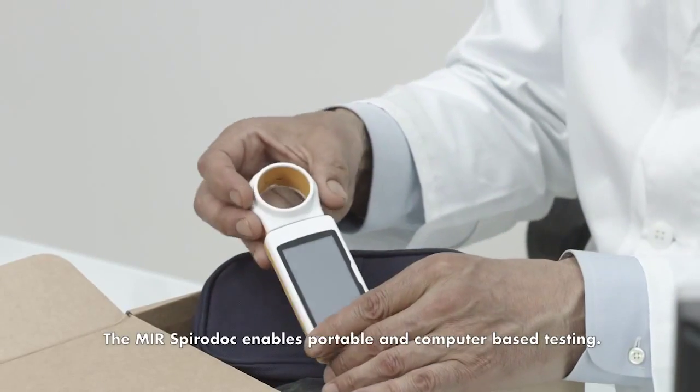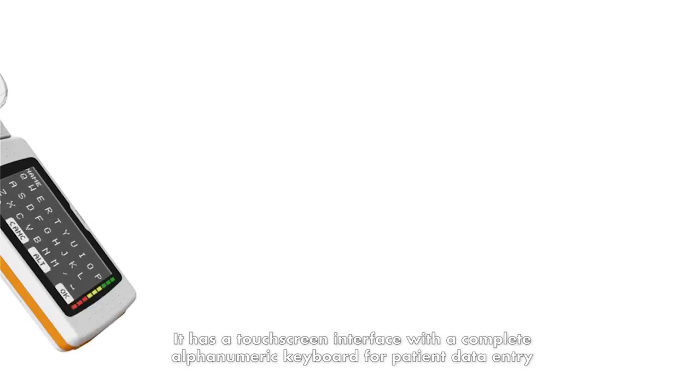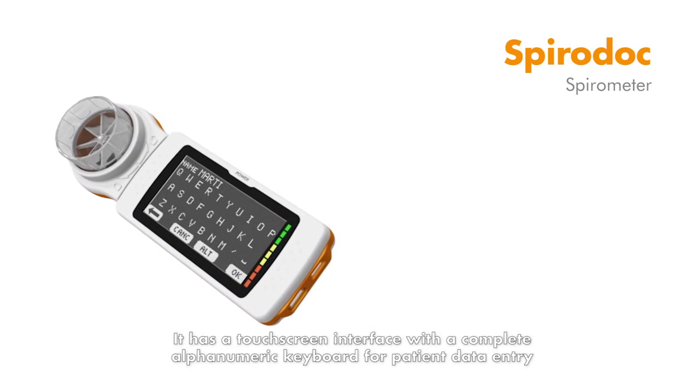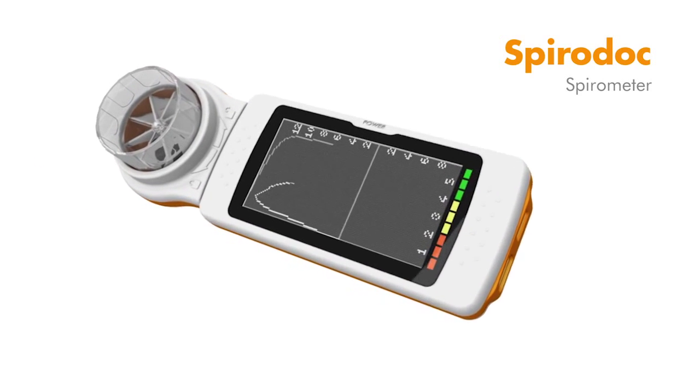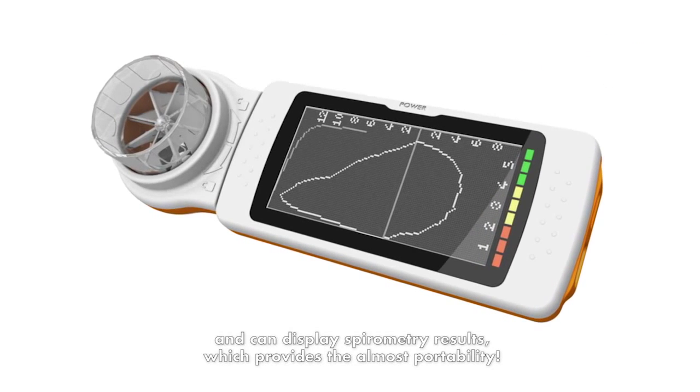The MIR SpiroDoc enables portable and computer-based testing. It has a touchscreen interface with a complete alphanumeric keyboard for patient data entry and can display spirometry results, which provides the utmost portability.